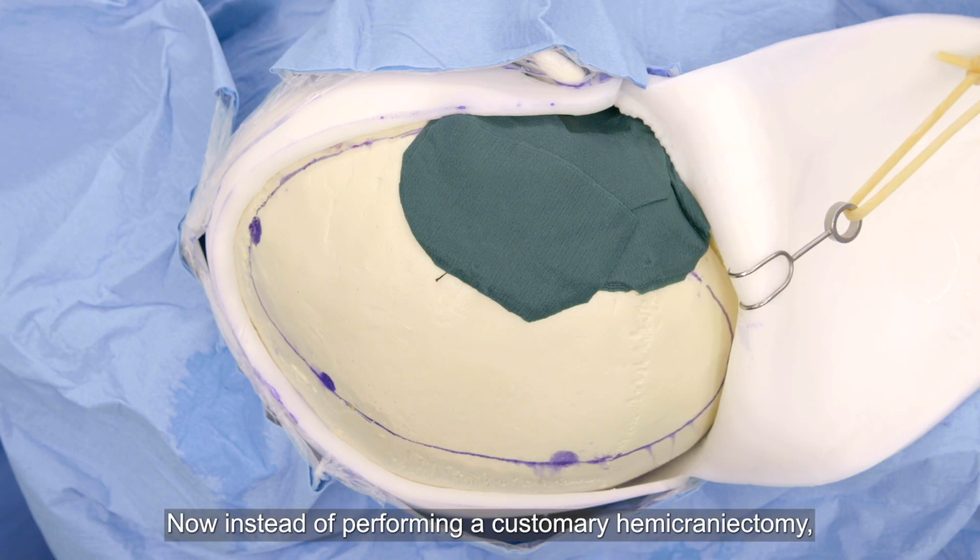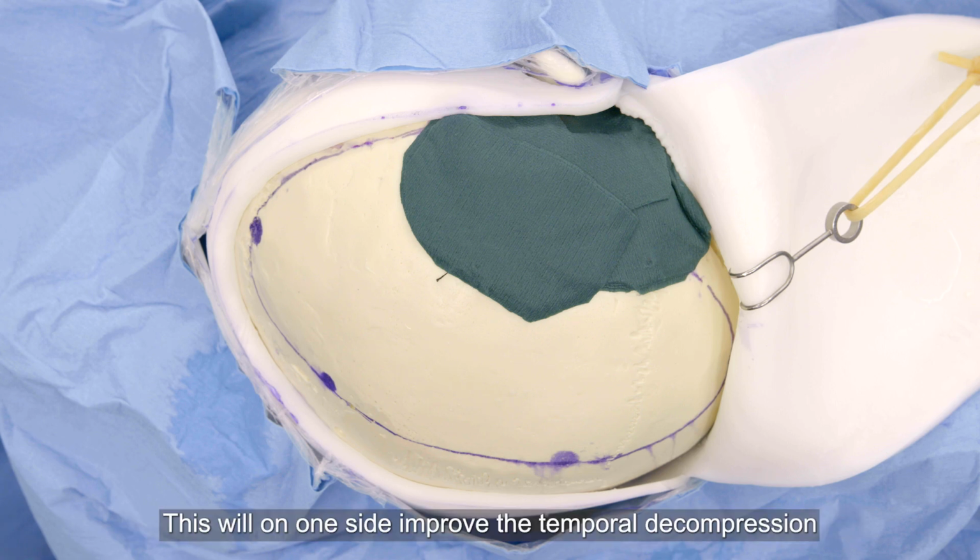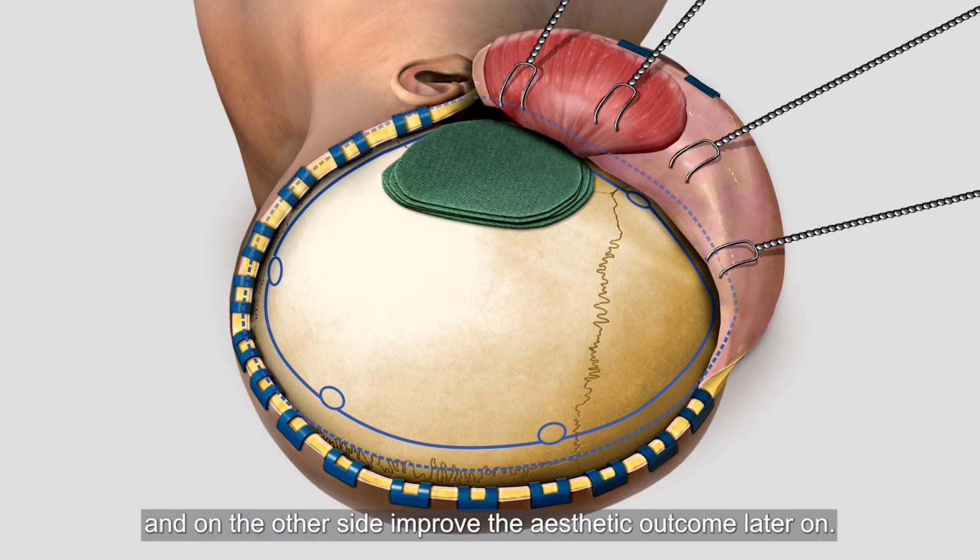Now, instead of performing a customary hemicraniectomy, proceed by putting some pads in the area of the temporal muscle. This will on one side improve the temporal decompression and on the other side improve the aesthetic outcome later on.